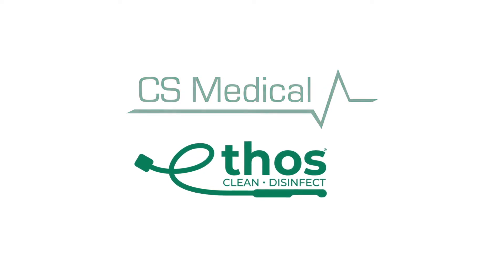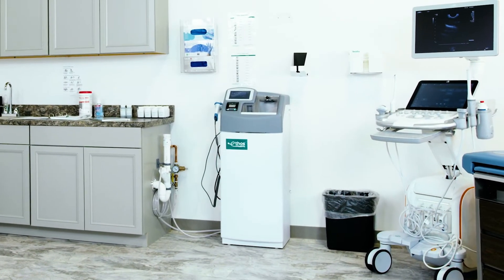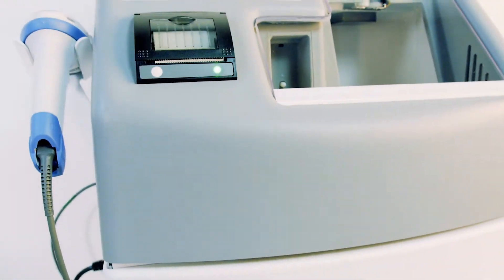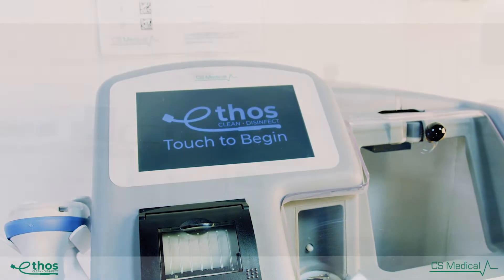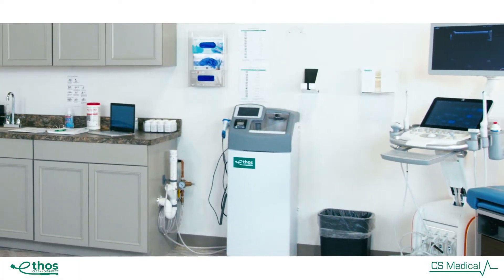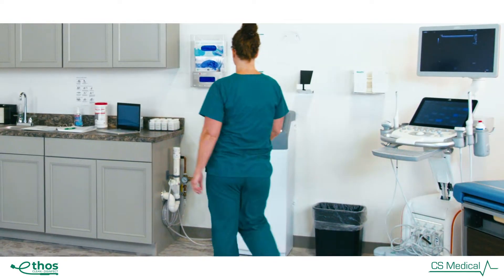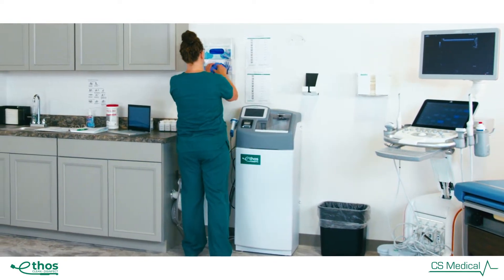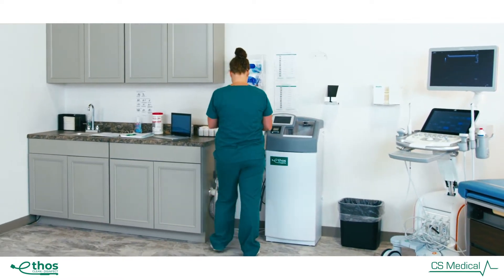Ethos Automated Ultrasound Probe Cleaner Disinfector is the first U.S. FDA-cleared device that provides automated cleaning and high-level disinfection for surface and endocavity ultrasound probes in one device.